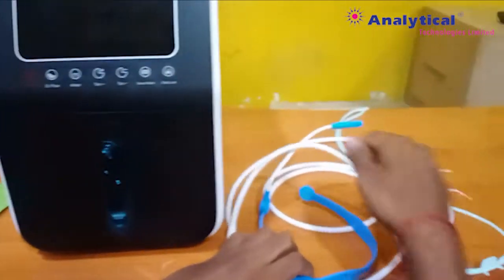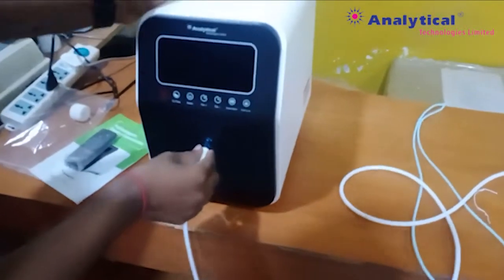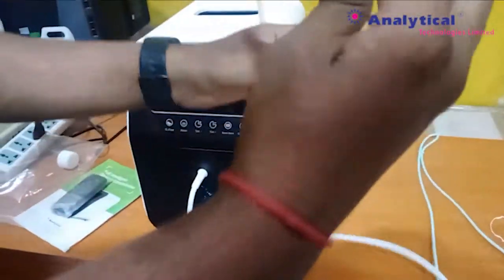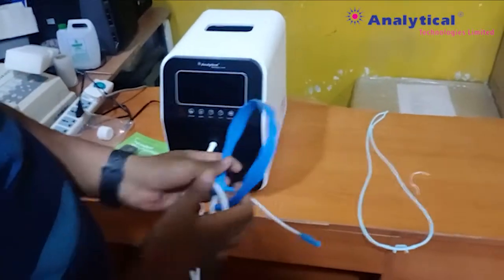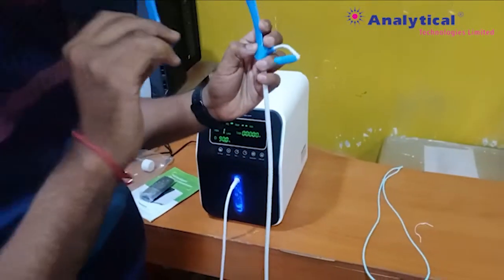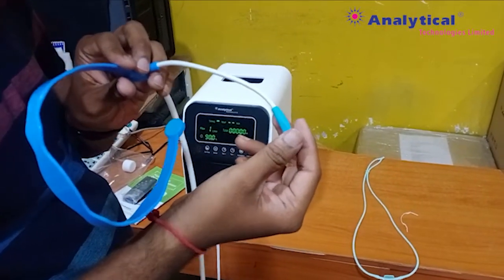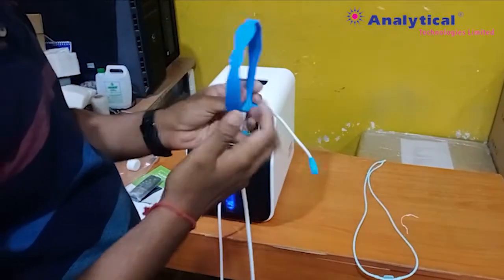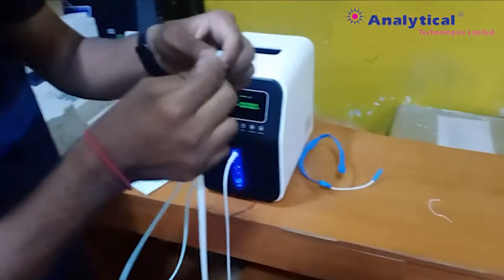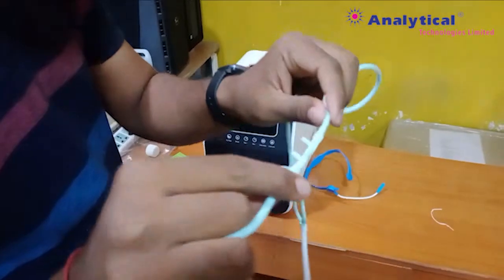This is the extra tubing. You can attach it like this. You have two modes. You can wear it like this and you can feel the oxygen. If you want to change this, you can attach this part and place it directly close to your nose.